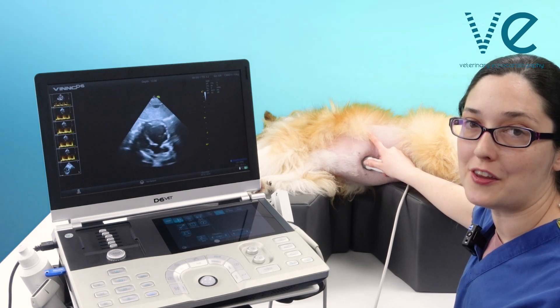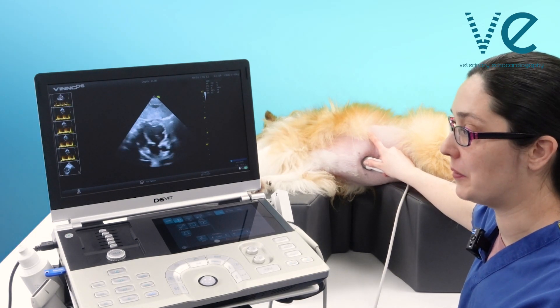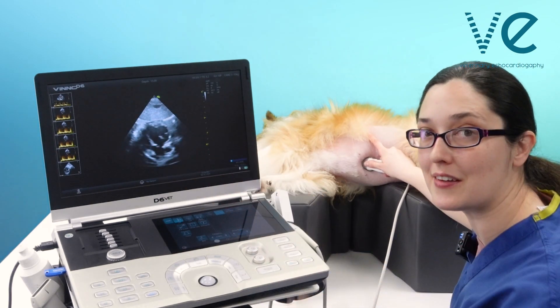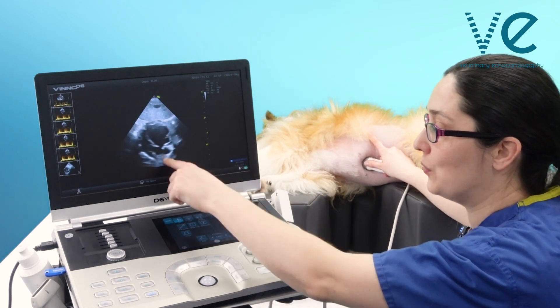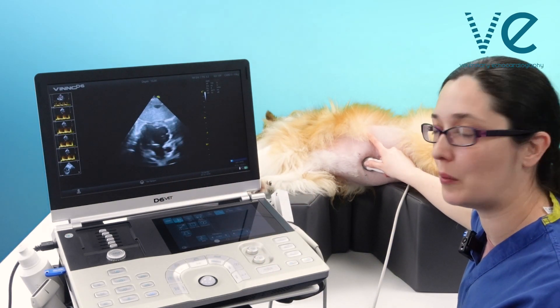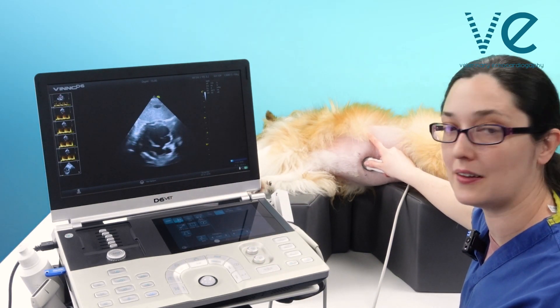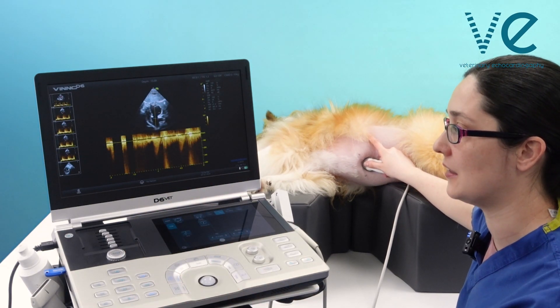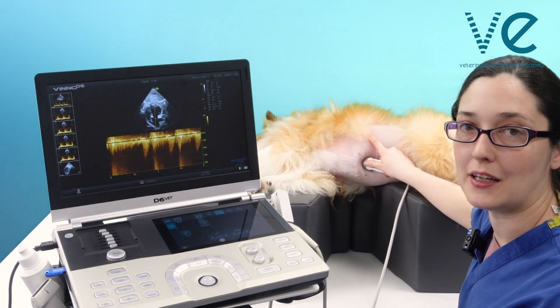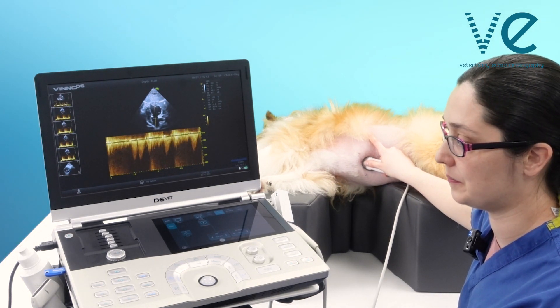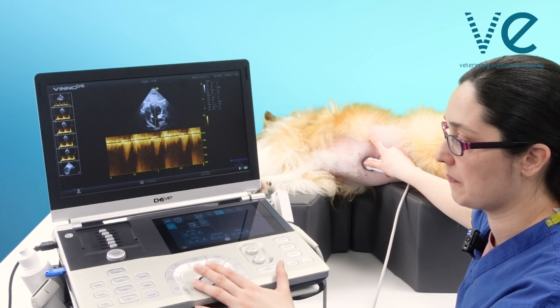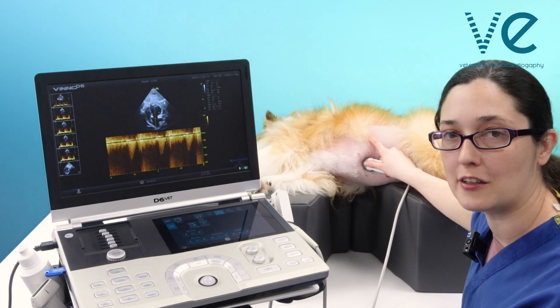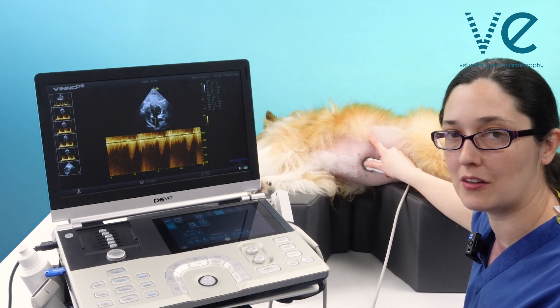This is why this view is so perfect for Doppler alignment — I can swing this around and make sure it's completely dead centre in my image. So that aorta is beautifully lined up with where my Doppler beam is going to be. I won't need to angle it at all, so I can just turn on my continuous wave Doppler and it's just straight down. Can't get any better alignment than that, and the better your alignment the more accurate your velocity measurements are actually going to be.